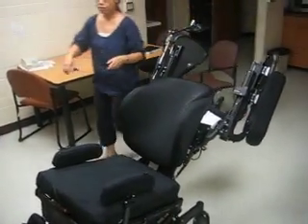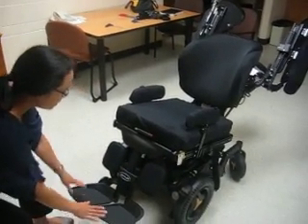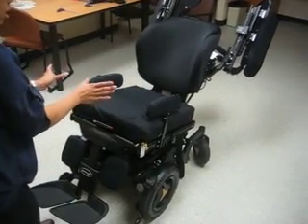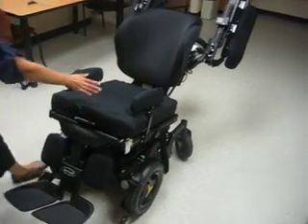The person at the front of the chair, with the foot plates down, guides the patient to be centered on the chair and at the same time pushes on the knees to try to get the patient right to the back of the chair.